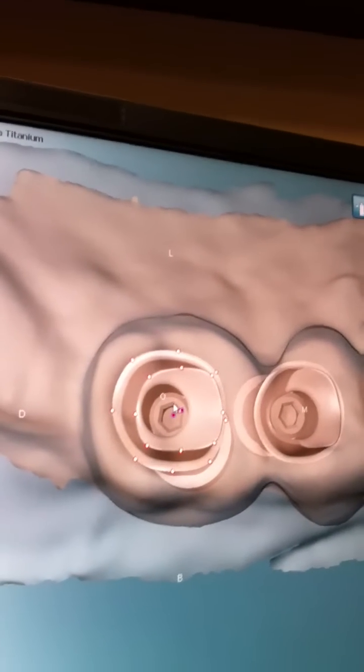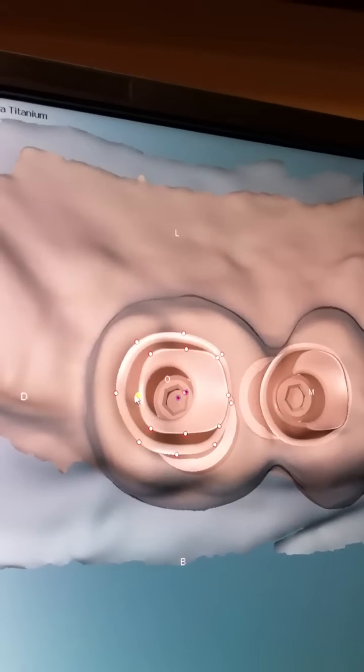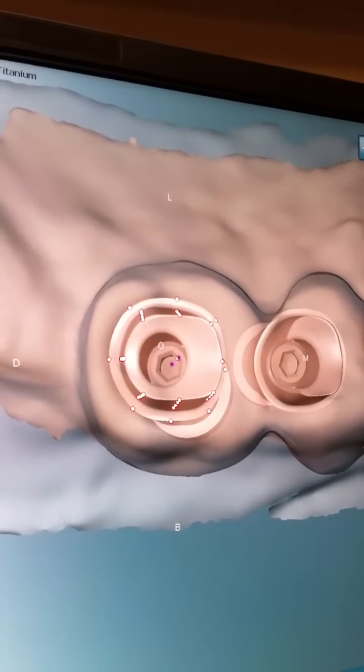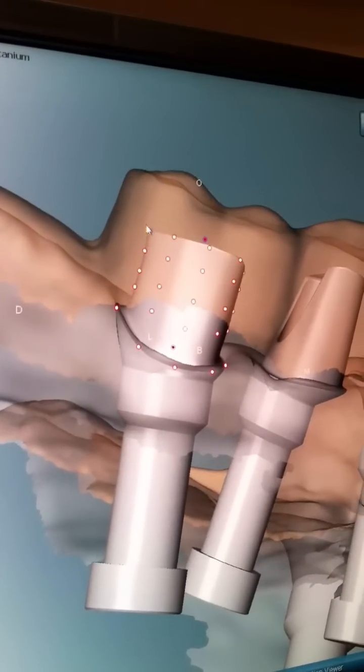That would be great. Okay. It's hard to clean cement around molars. Okay. It'd be wonderful. So let's just bring that out a little bit. We'll just add some handles. And we'll go ahead and shape that for screw retain.